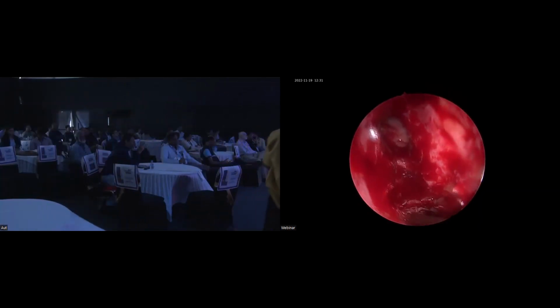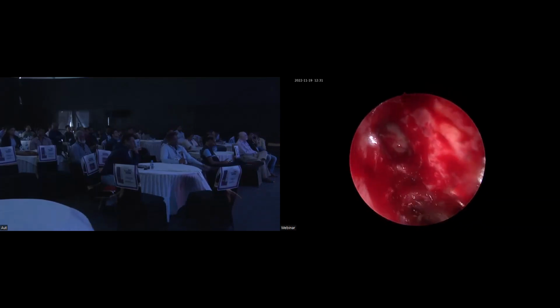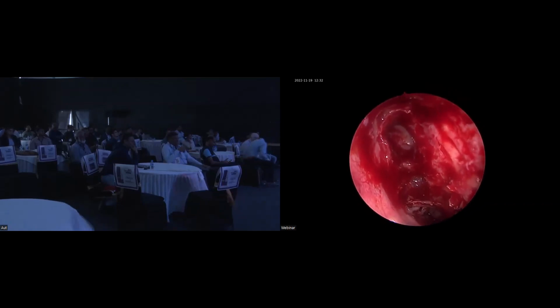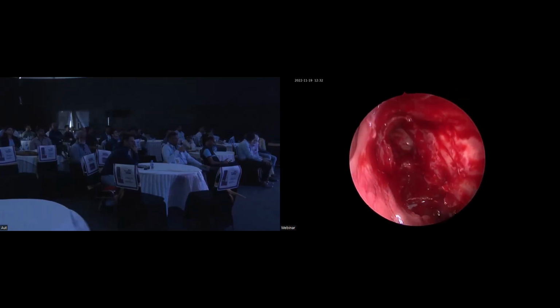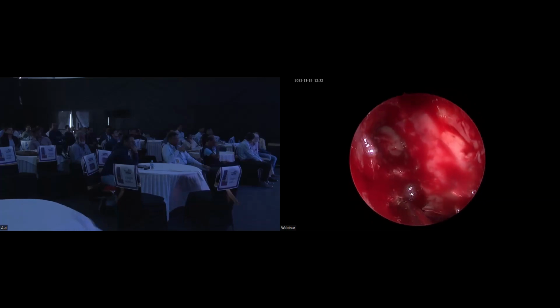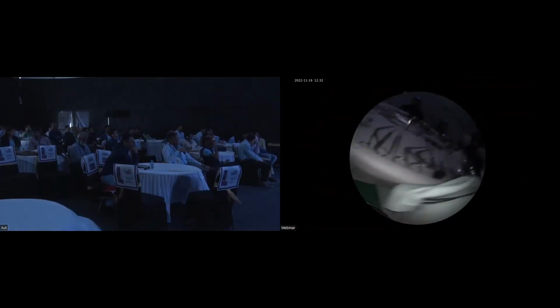So Satish was standing behind and said, Nikal de. So my navigation was there behind. Little hazy picture. Let us clean the tip.